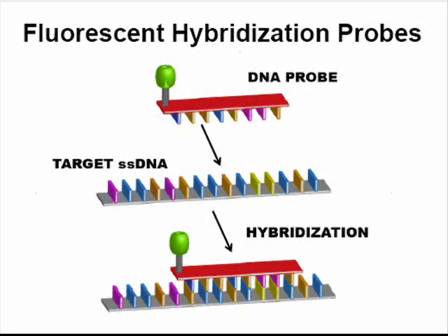The next slide shows fluorescent hybridization probe methods. This method, as stated previously, is totally dependent on the use of an engineered probe coupled to a fluorophore. This is very specific. As you can see at the very top, we have the DNA probe.